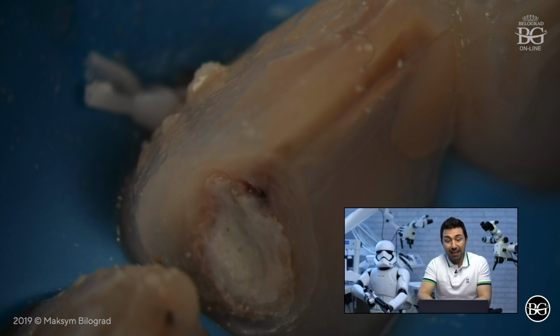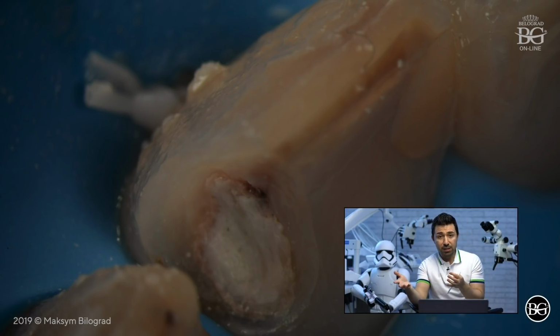Perfect. So in this case, you can see some kind of old dentistry. It's like liners or cement liners, because sometimes people still think that composite material may cause pulp necrosis because of the toxic action of monomers, which is not true, because modern composites are not as toxic as they were maybe 30 years ago. But since that time, we still have some dental cases with so-called protective liners as cements to prevent toxic action of composite materials.